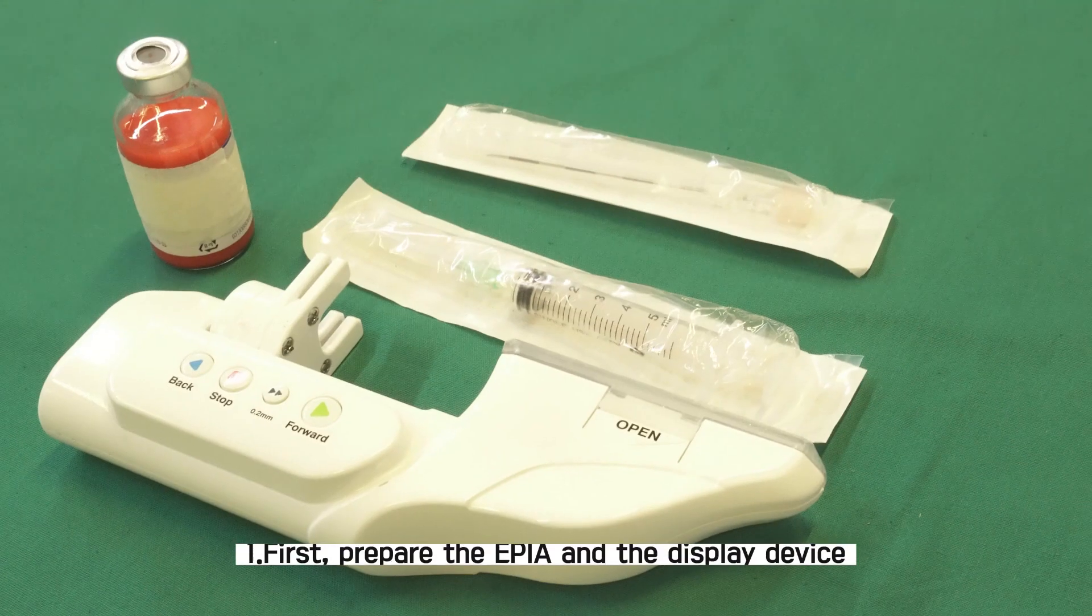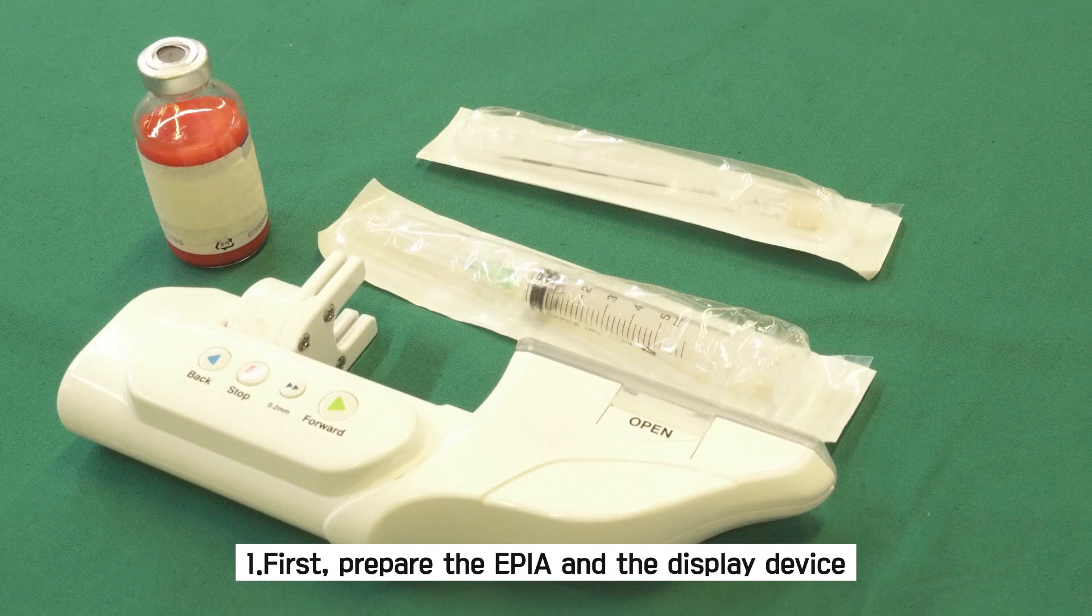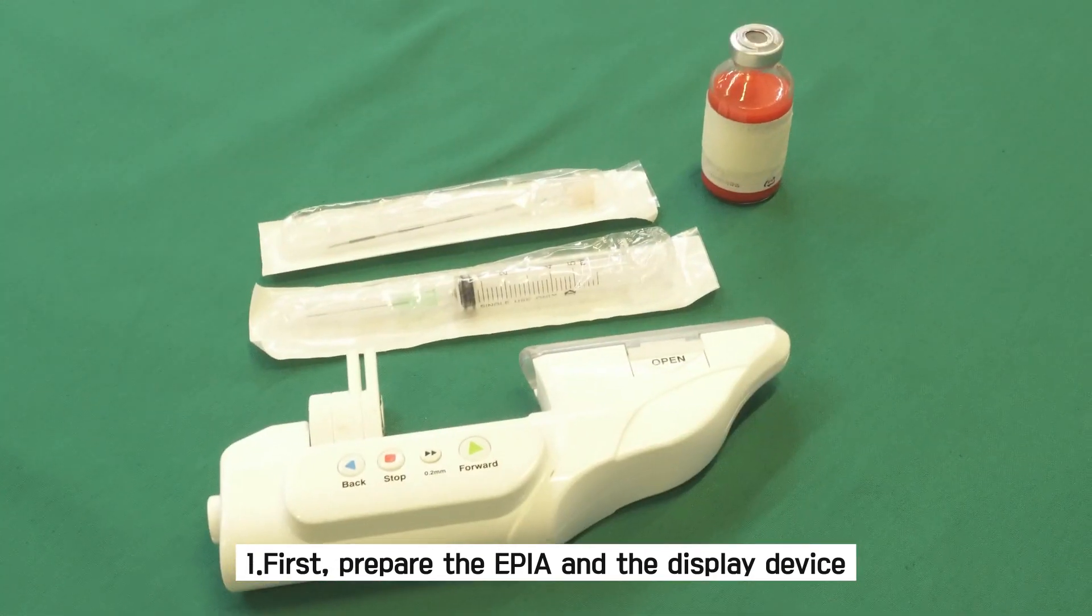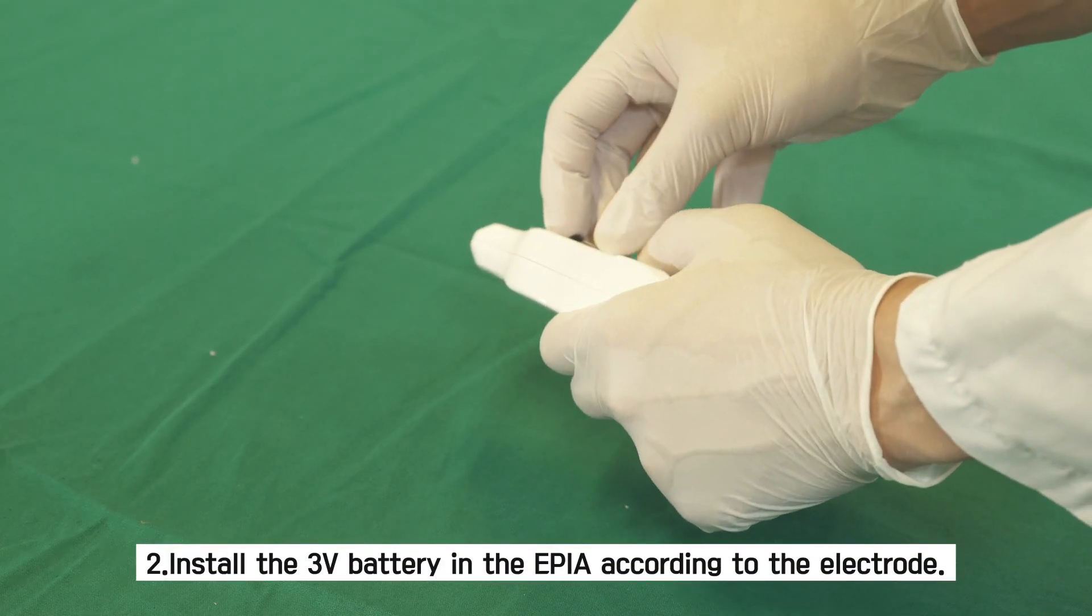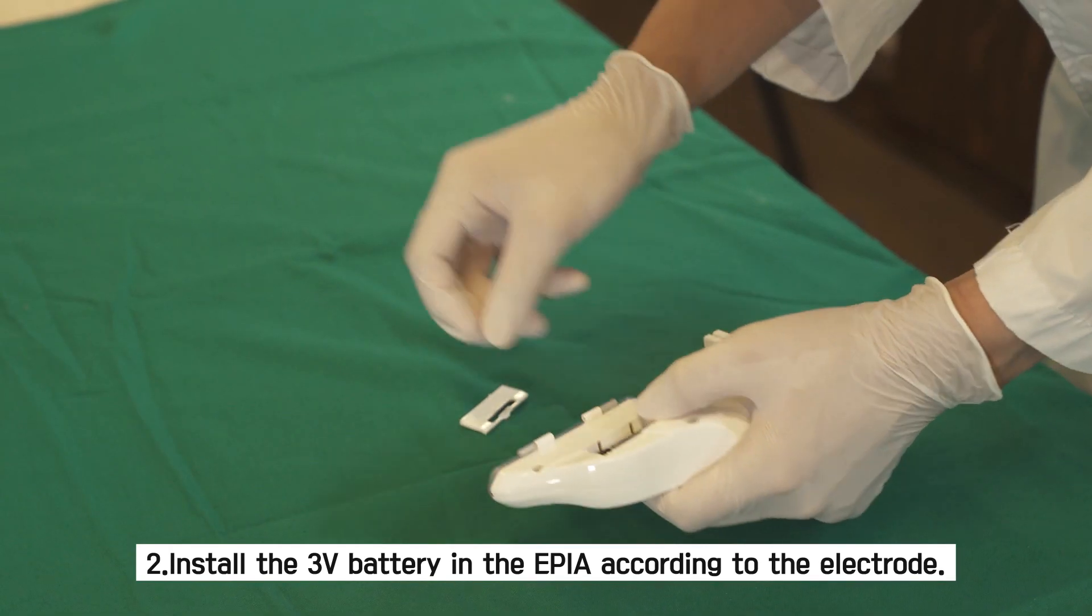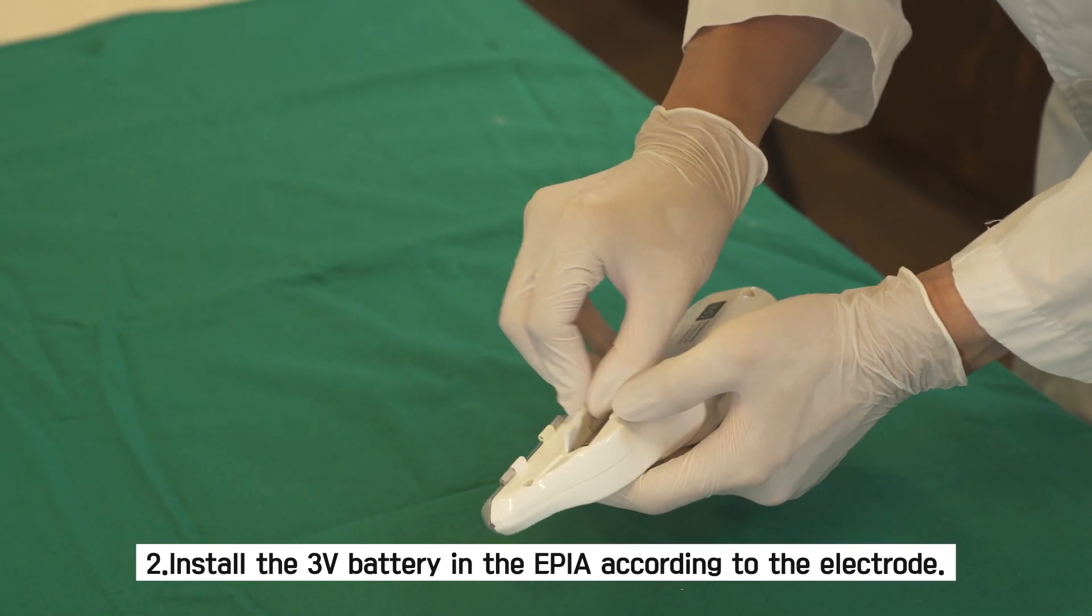Preparation. First, prepare the EPIA and the display device. Second, install the 3-volt battery in the EPIA according to the electrode.